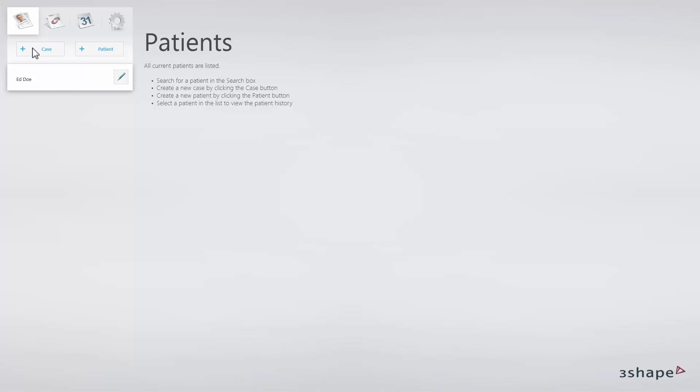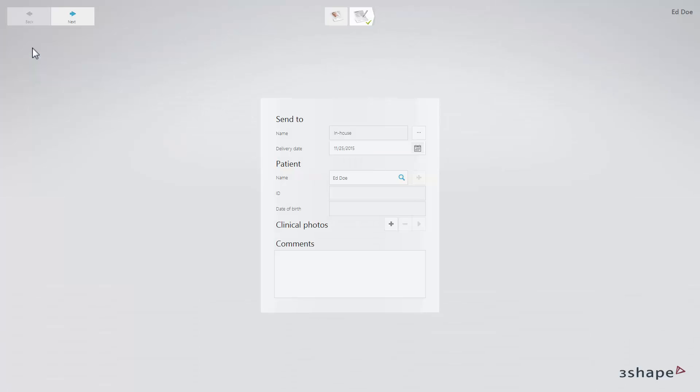Click Case to create a case for the selected patient. If needed, click Change Lab icon to select a different lab.